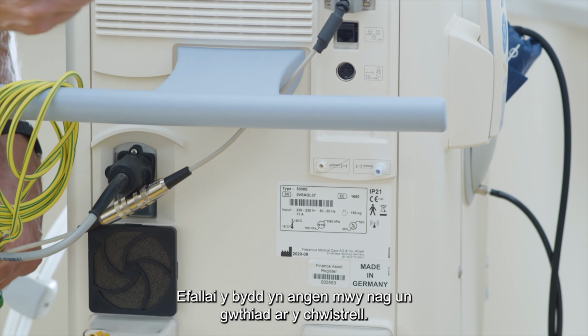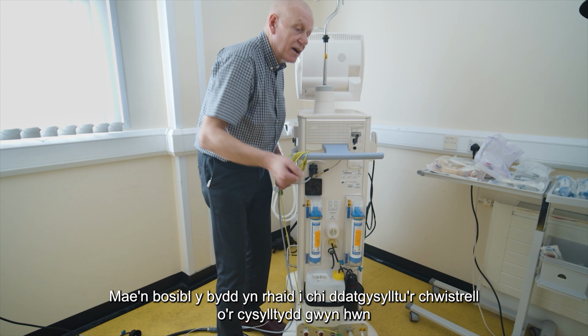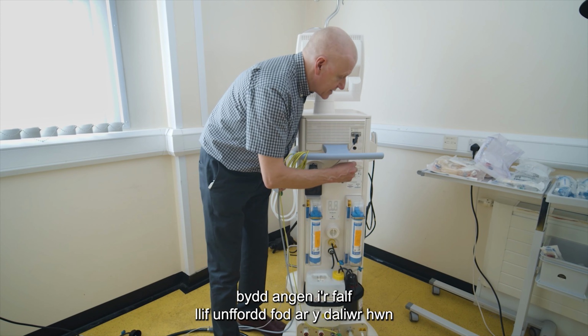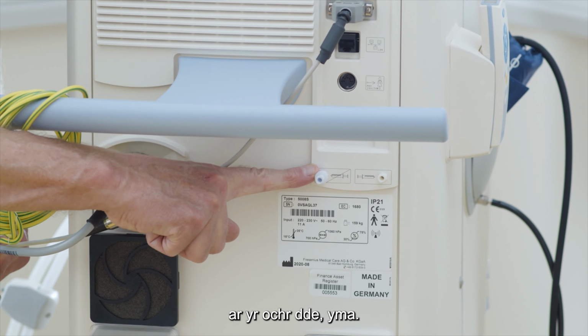It might take more than one push on the syringe. You may have to disconnect the syringe from that white connector and give a second push on it. When not in use, that non-return valve needs to sit on that holder there to that side, by there.